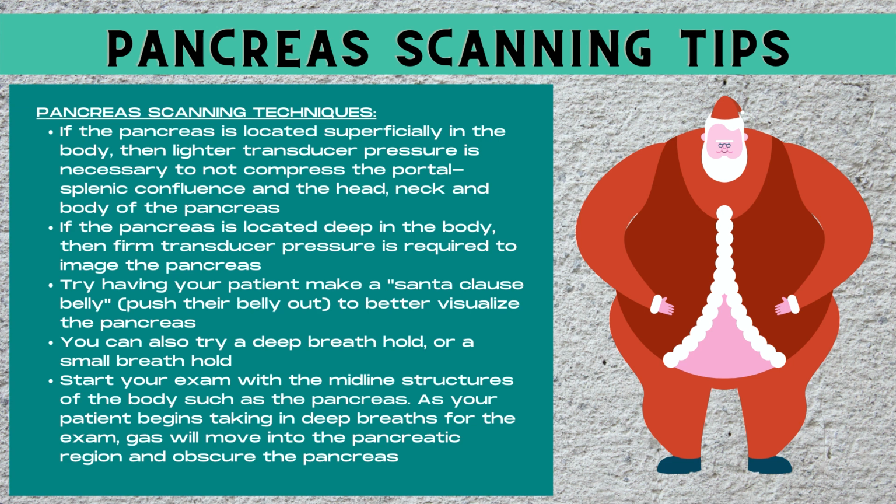When the pancreas is located deeper in the tissue, then firm transducer pressure is required to image the pancreas clearly. One of the best tricks for being able to see the pancreas better is to try to have your patient make what we call a Santa Claus belly. This means push their belly out. Often, this is the best technique to use when imaging the pancreas. You can also try a deep breath hold or a small breath hold.